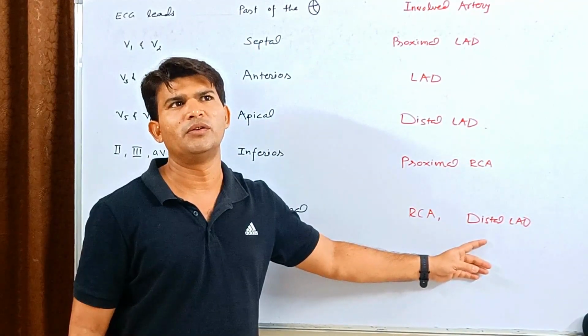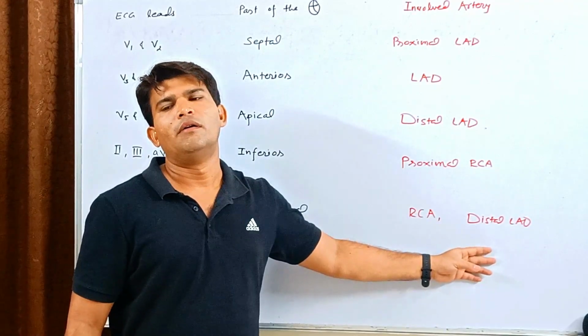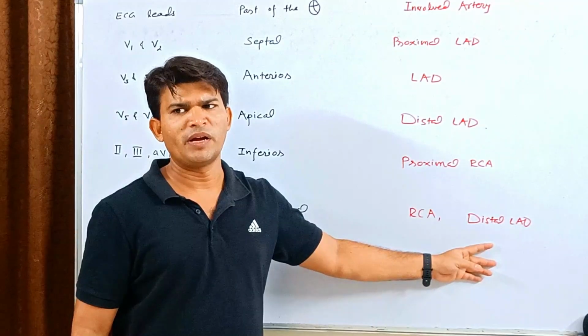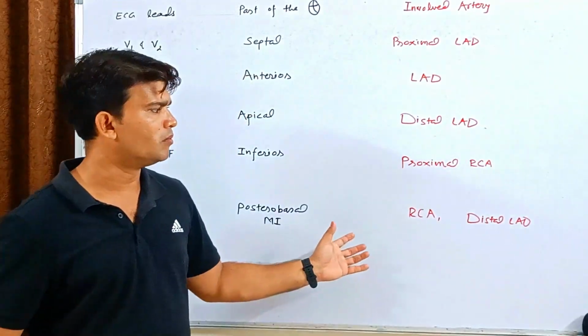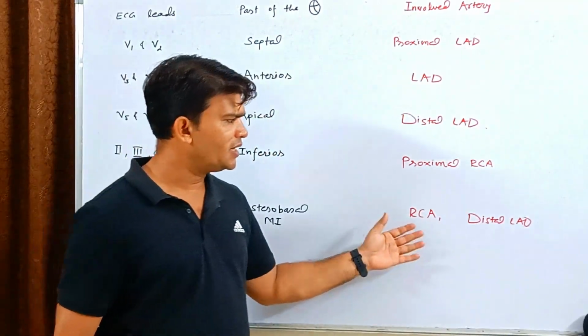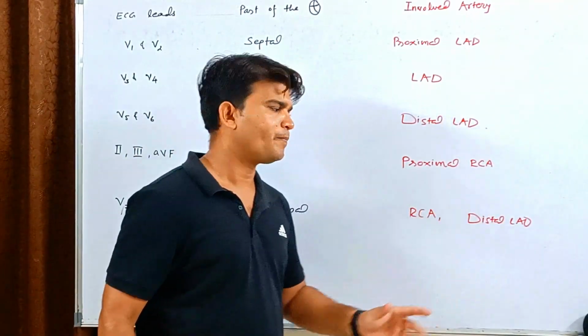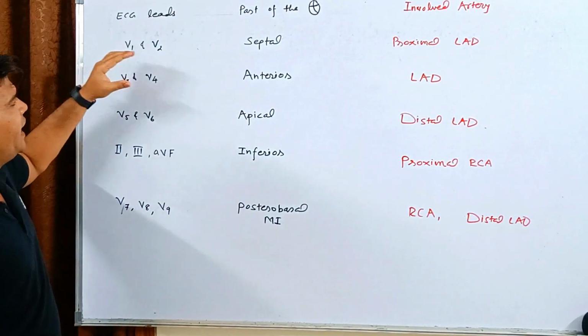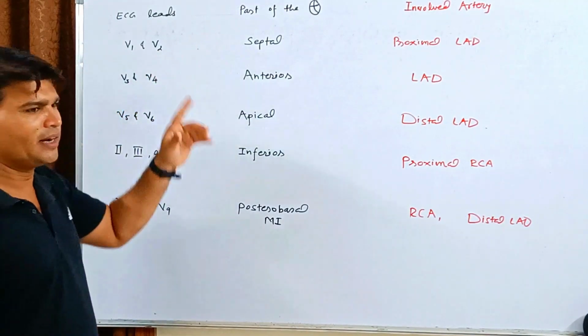Patient will develop, you can say, more apical signs and symptoms of apical wall. But if more than 2 arteries are involved, then atheromatous plaque should be here and here also, right? And see, if we see anteroseptal wall MI, then you can recall.